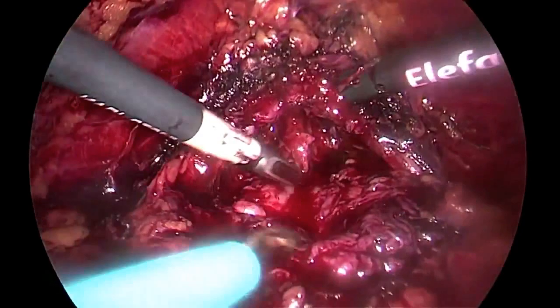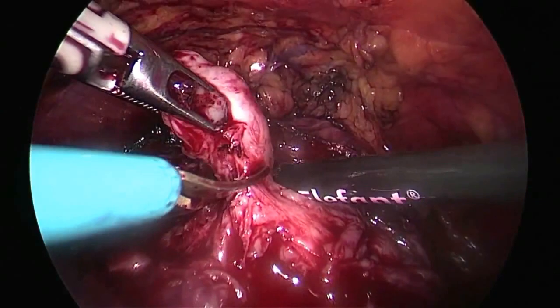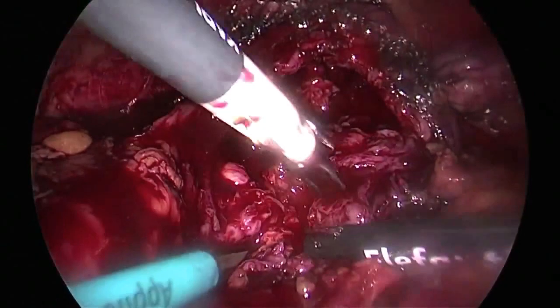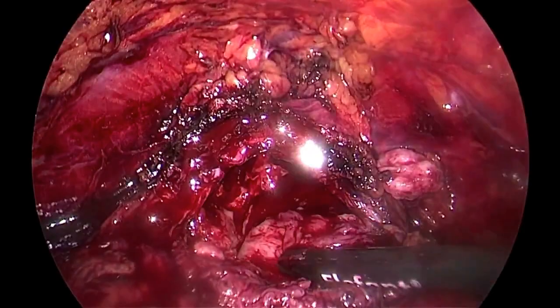Wait, monopolar, please. Again. Okay. Can you show me now the bladder neck? It should be here. It's here. Okay. Can you give me Jean, please? One moment. Okay, thank you.